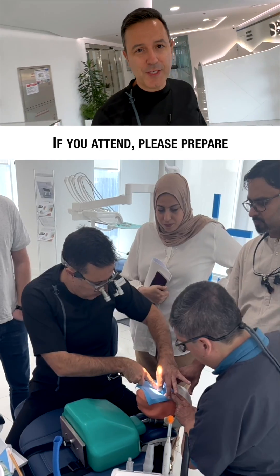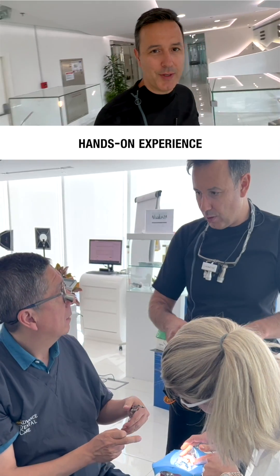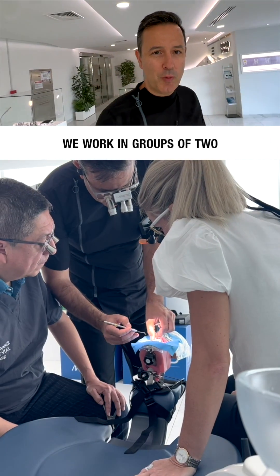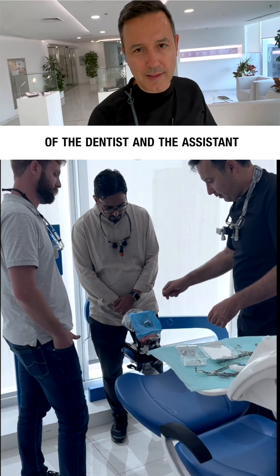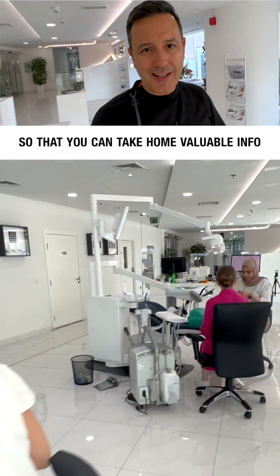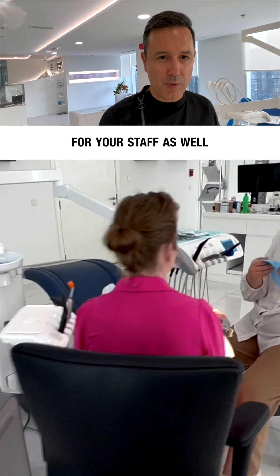If you attend, please prepare for a really intense hands-on experience. Only six participants. We work in groups of two on three dental units with mounted mannequins. We practice both the roles of the dentist and the assistant, then switch roles so that we can take home valuable info for staff as well.